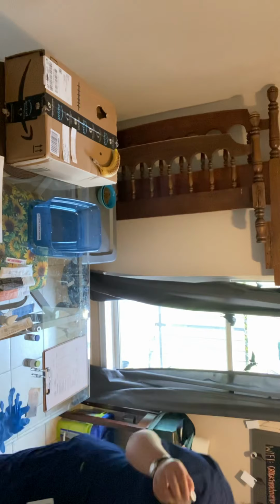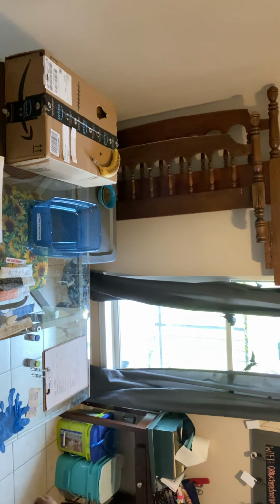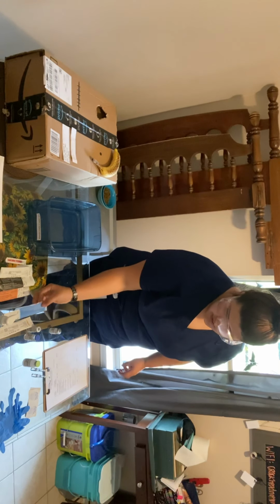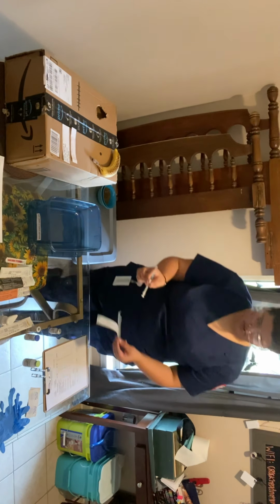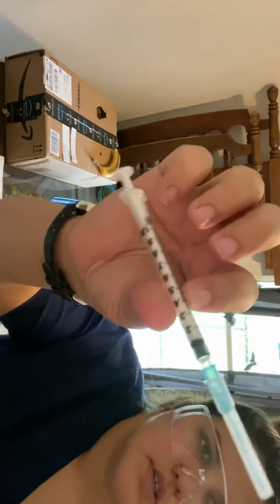Now I'm going to verify. This is heparin, 10,000 units per milliliter. Expiration date 2025, so the medicine has not expired. Now going to pick my syringe. I'm going to use a 1 milliliter TB syringe since I'm only administering half a milliliter. I want to open and maintain sterility. Just going to verify that this is the TB syringe. TB syringe, 1 milliliter. Here is the packaging.